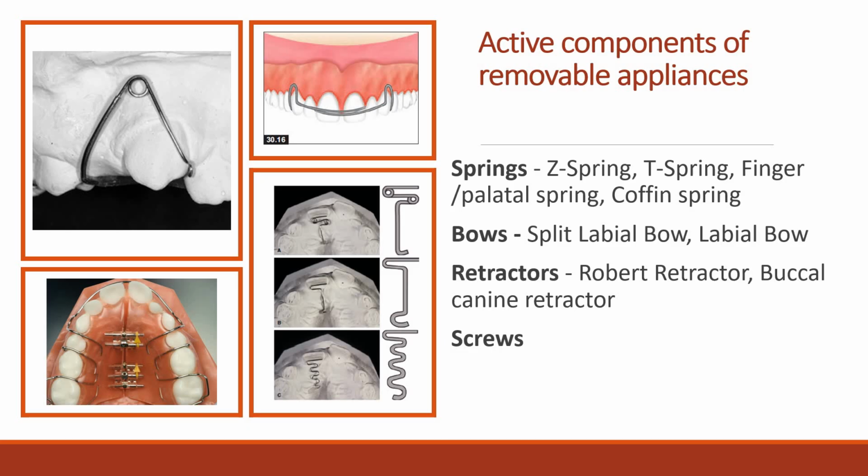However, simple removable appliances retain a place in modern orthodontic practice, usually as an adjunct to fixed appliance therapy or for use in the retention phase of treatment. In particular, a group of predominantly removable functional appliances used primarily in the management of class 2 malocclusion have enjoyed a considerable resurgence in popularity in recent years. In addition, new treatment systems using vacuum-formed removable appliances, not only for retention but also for active tooth movement, have been developed.